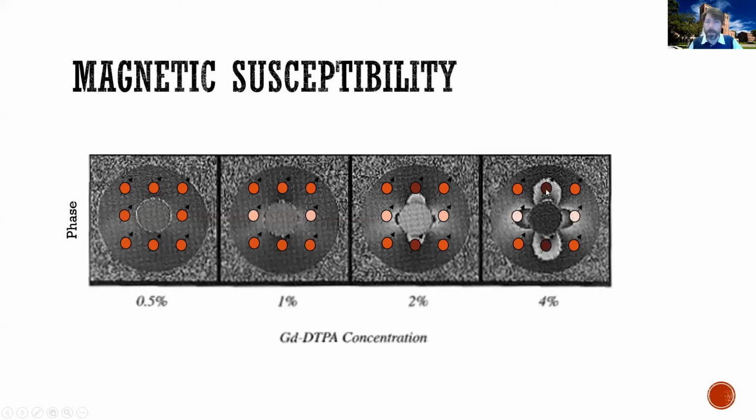Maybe, right? Maybe these 2 will be resonating much faster than the other protons, so their Larmor frequency might be much higher than the other protons. These 2 protons might be resonating at much lower Larmor frequencies. So now, again, we inject the radio frequency pulse, we stop the radio frequency pulse, we let the protons resonate for 20 milliseconds, then we look at how in phase they are. Well, these protons probably will go very much out of phase very quickly.